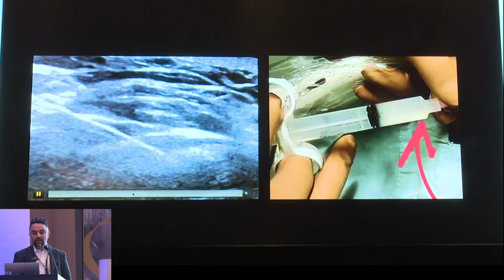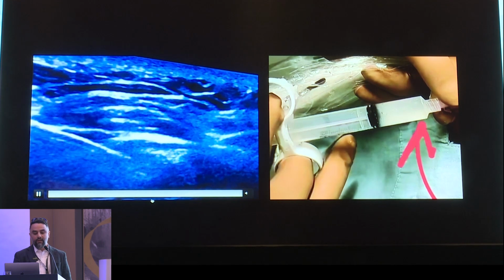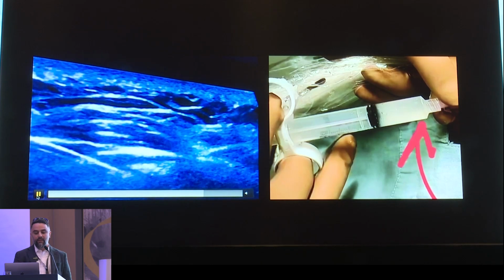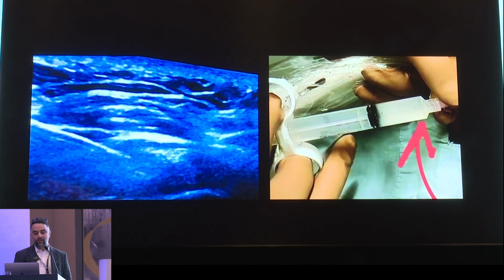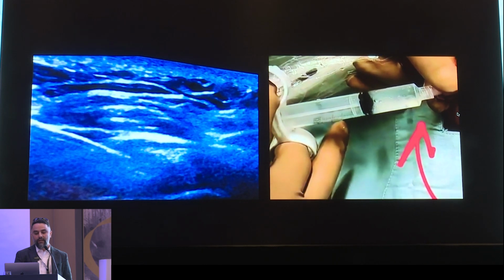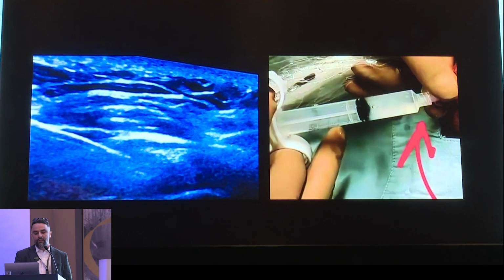Now, this is a typical appearance we described as a fish mouth opening while you're injecting. It's a one injection technique, or one needle. And you will find it very satisfying when you see the calcium coming out while you barbotage.